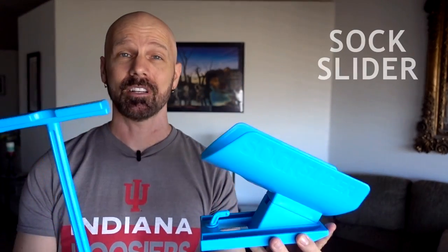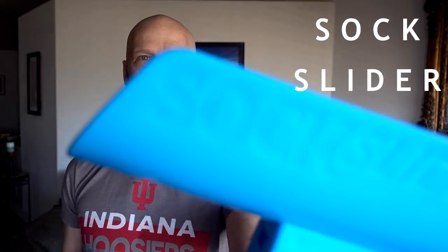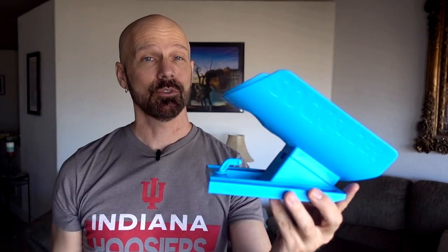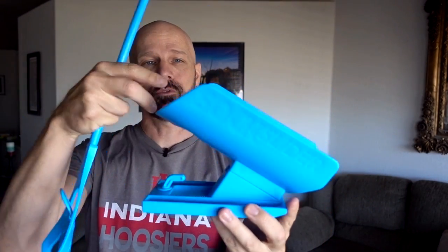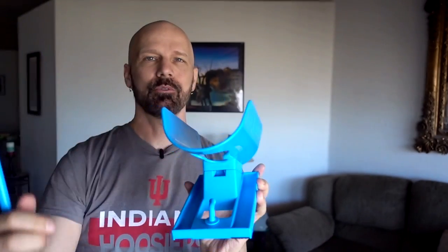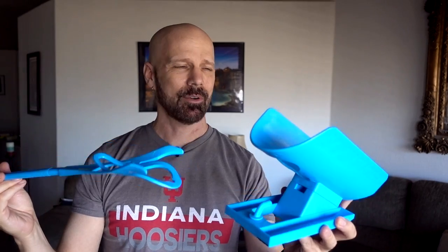Sock Slider is a device that allows you to put on and take off socks more easily. That's today's review, so let's check it out. Sock Slider consists of two pieces: the base and the handle. You put your sock over the opening, lower it to the floor, put your foot through, and the sock is supposedly going to be on your foot without having to bend over. You can also use the handle to take socks off and use it as a shoehorn.